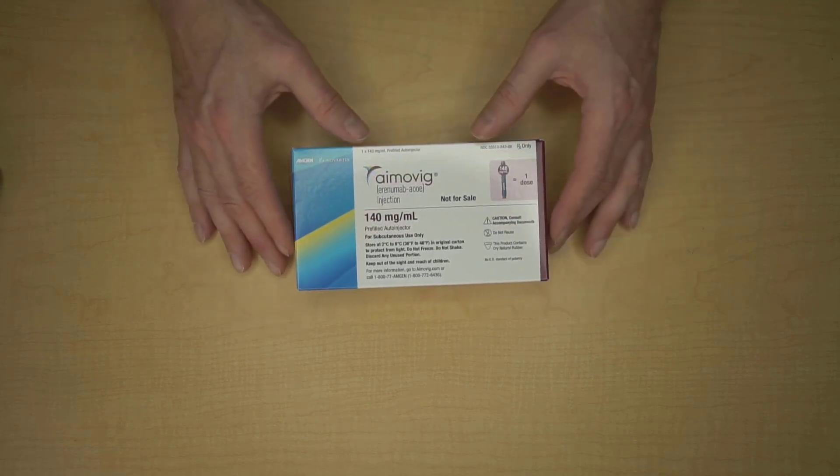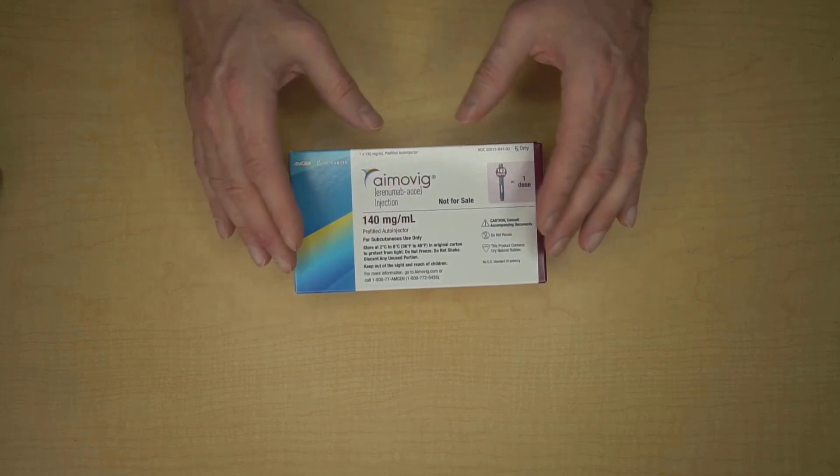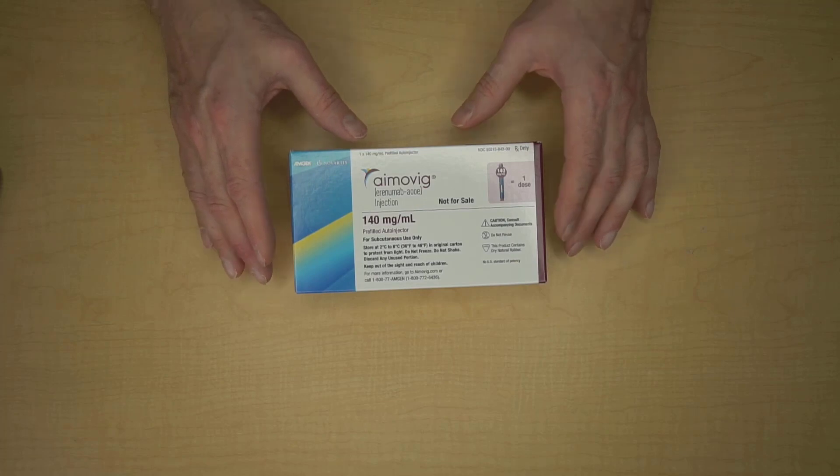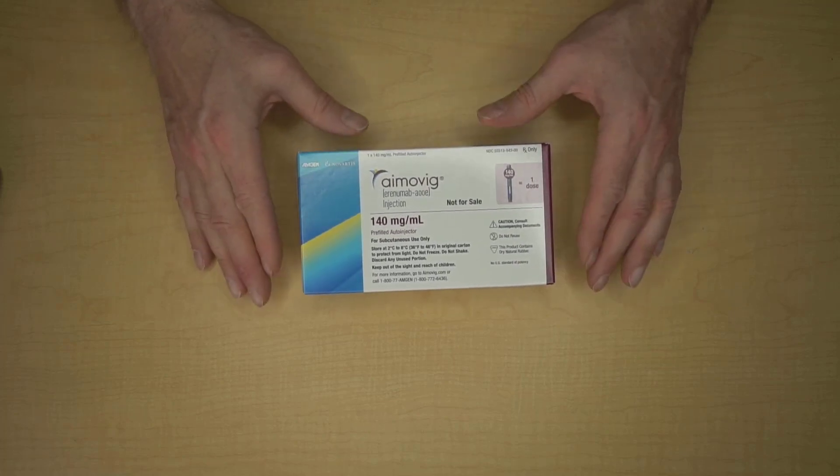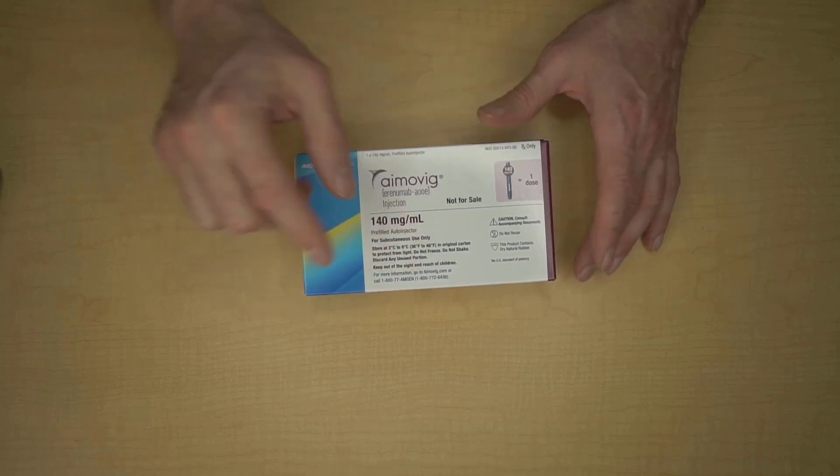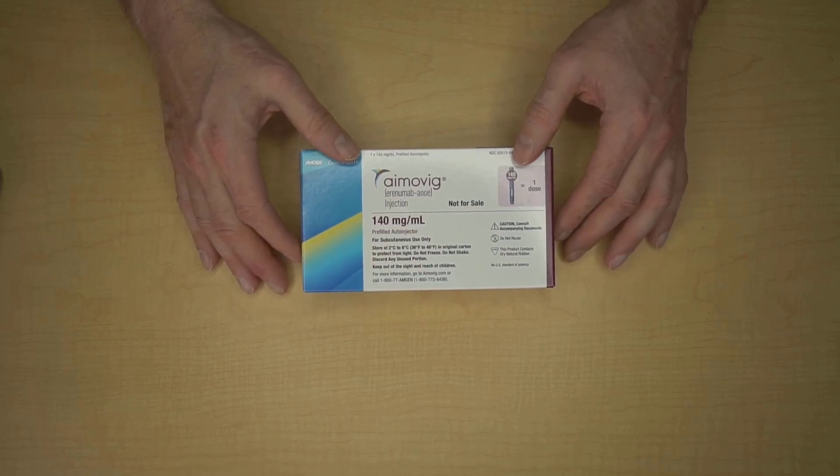So at this point Amovig has been out of the refrigerator and resting at room temperature for 30 minutes, and that's probably the biggest thing that you can do to make sure that your Amovig injection is comfortable. Don't shake it. Don't drop it on the floor. If you think that you've damaged your injector, all you have to do is call Amgen and discuss it with them, and generally they can arrange a replacement for you.